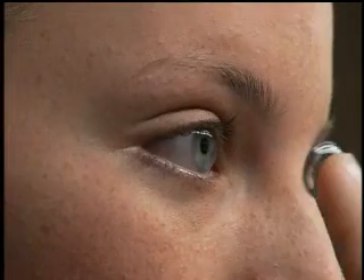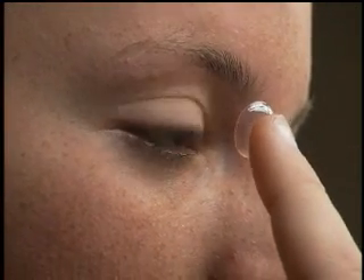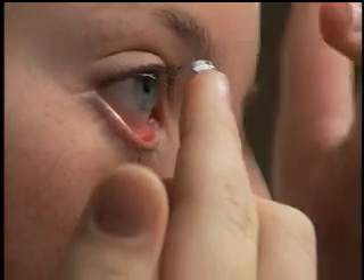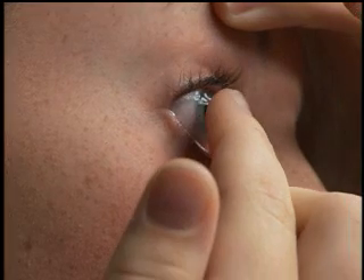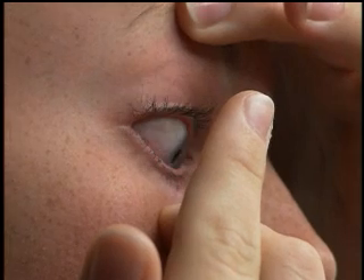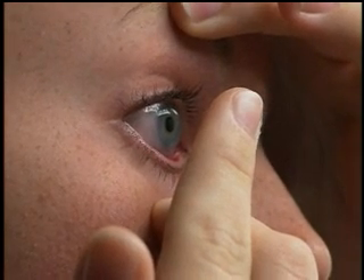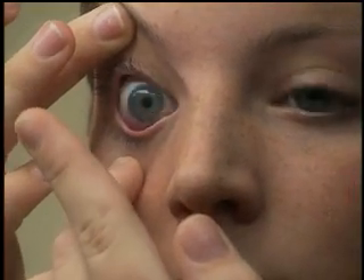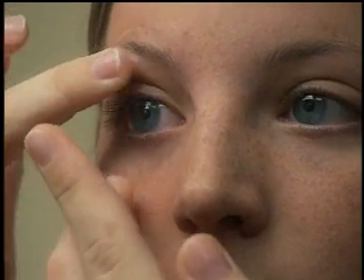Let's start with the first lens. Look straight ahead and hold the finger with the lens up to your eye. Then use your middle finger to pull down your lower eyelid. With the middle finger of your other hand, lift up your upper eyelid and put the lens on your eye. Once the lens is in, look slightly from side to side to make sure the lens is on. When letting go of the lid, let go slowly and gently close your eye. The most common mistake of a new wearer is letting go of the lid too quickly and the lens pops out. It's okay to blink a few times — this will help center it. How does that feel? Feels great.